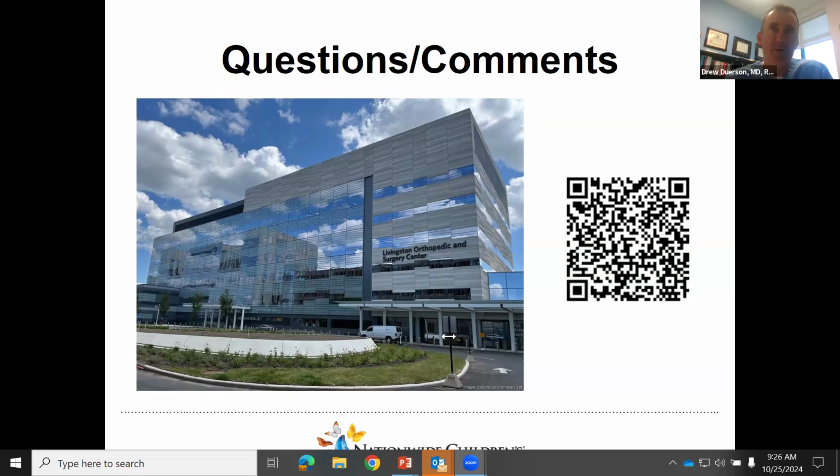At first I thought it looked potentially bony. It didn't cast a big shadow. I didn't see a clear donor site. That articular cartilage defect was nearby, but it didn't look necessarily like cartilage to me. So full disclosure, this patient did go on to have an MRI, which I didn't include in this ultrasound talk, but it did identify the MPFL injury, did identify the articular cartilage injury, but did not have a loose body. So I think that was probably just related to the injury to the medial retinaculum and MPFL. I did not identify an obvious loose body on the MRI.